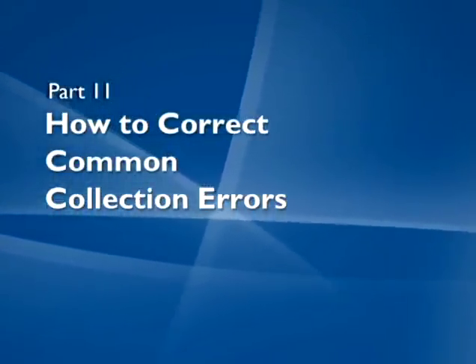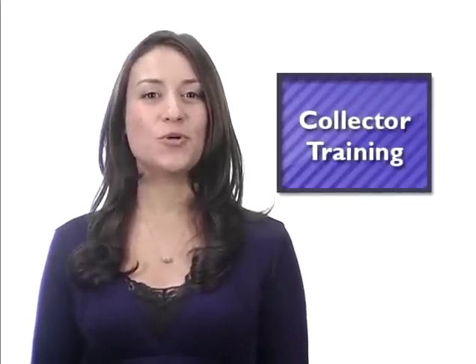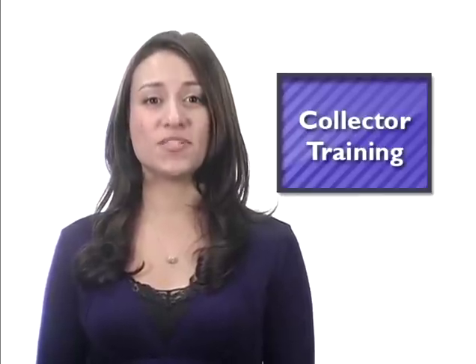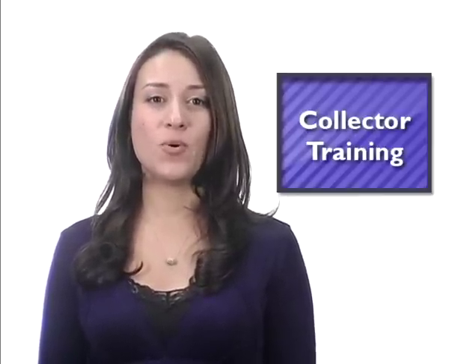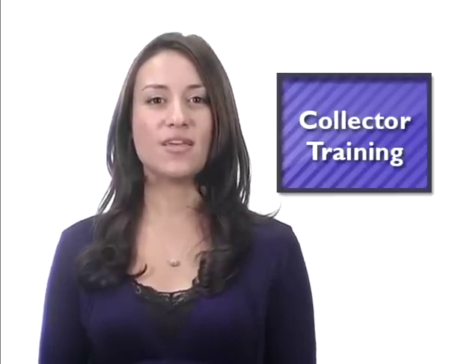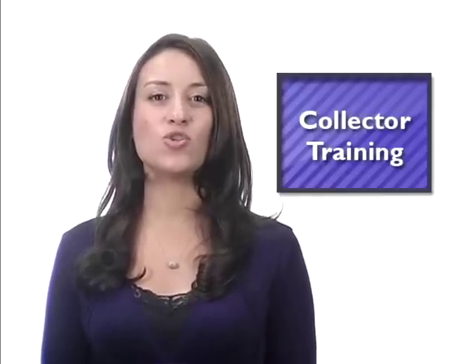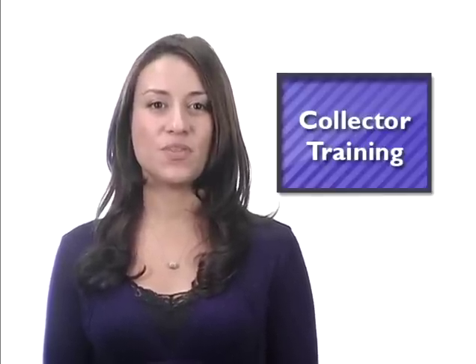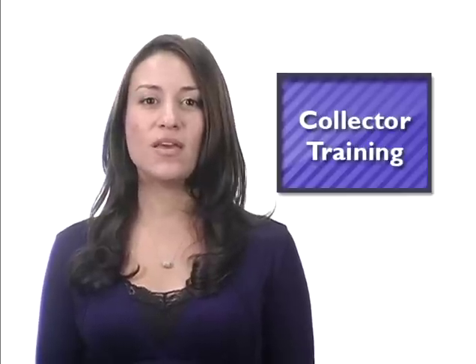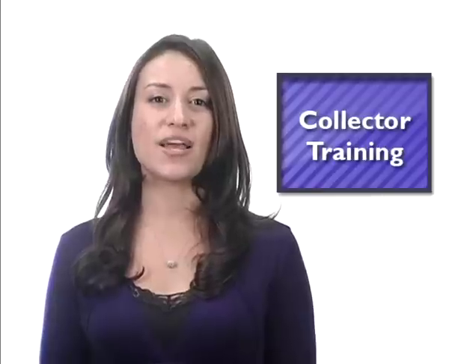As the collector, you must make every attempt to correct an error in the collection process. When you discover an error, correct it promptly. This applies to both paperwork and procedural problems. In later stages of the testing process, the laboratory and MRO are also responsible for identifying and trying to correct collection errors. You will want to make sure that the correction will rectify the problem. If necessary, you may begin a new collection, as long as the donor has not left the collection site.